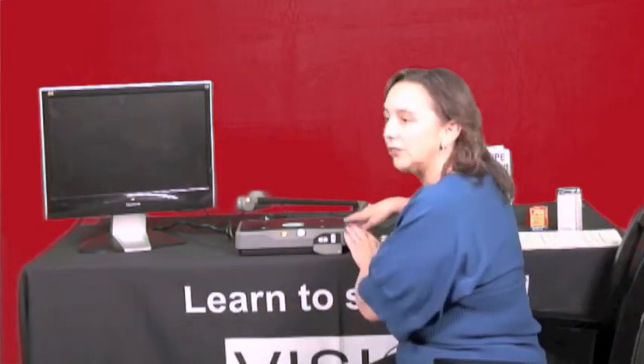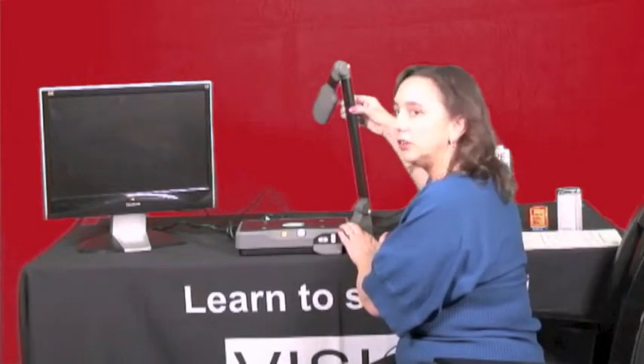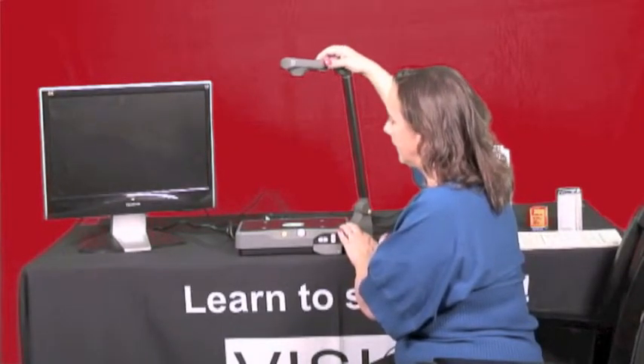Once you get everything plugged in, you're going to want to lift up the arm of the camera and you'll hear a click — that tells you it's in place. Then the camera comes up and we're ready to go.